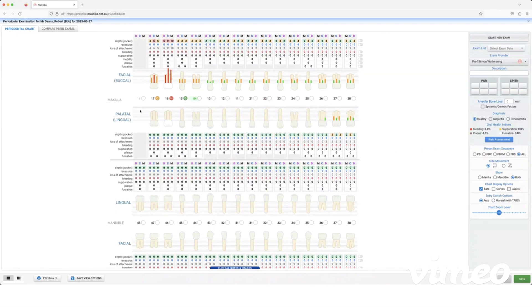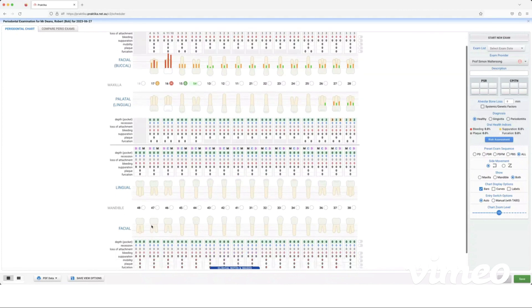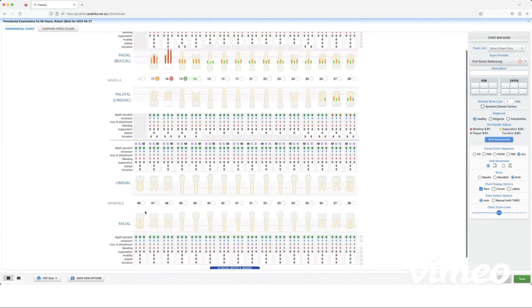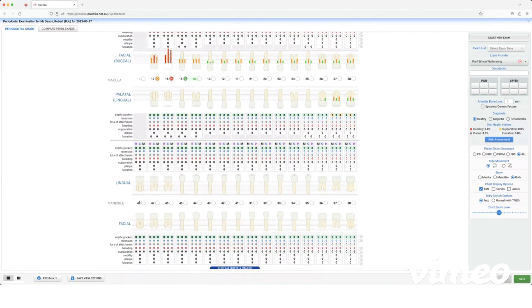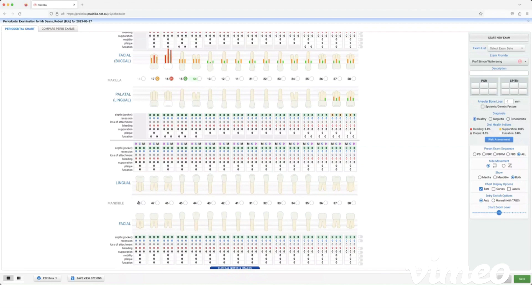Now before you start your chart as well, you have the option to mark teeth as missing or you can change their tooth type. It has to be before you start the chart though. So if I want to change the tooth type or mark a tooth as missing or an implant, I can click on the actual tooth number itself, not the box, the tooth number, and I can change it from here.